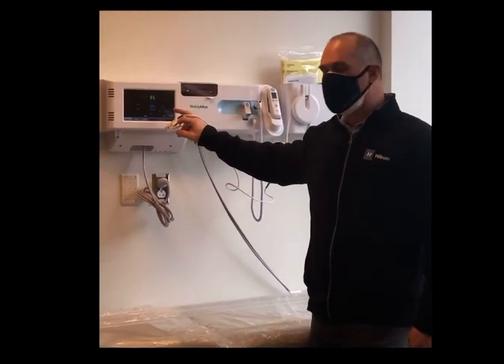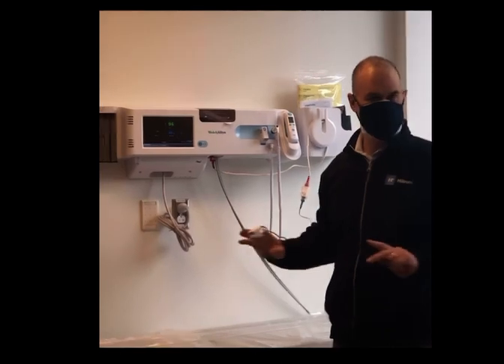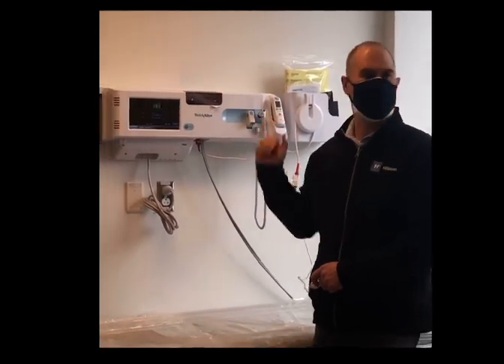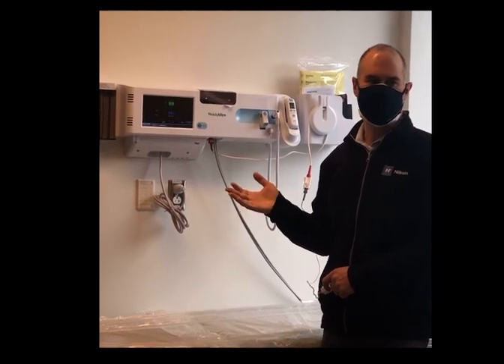So at what point do we stop it? Because it keeps going — it's going to be 91, 92, 93. Whenever you're comfortable that the patient is at rest, you take this off and it stops, and it reads the last reading before it was taken off. So I would give it at least 15 seconds.